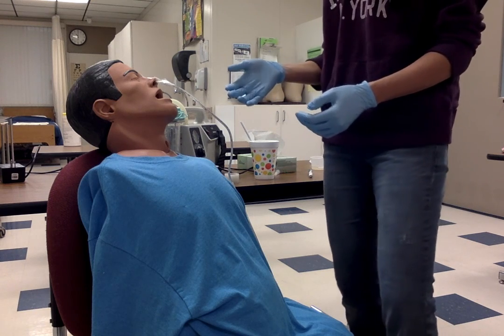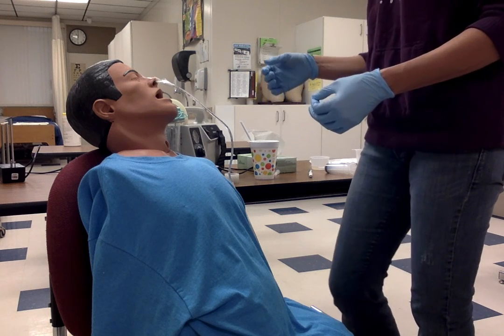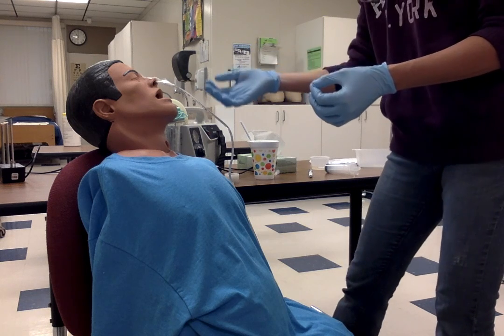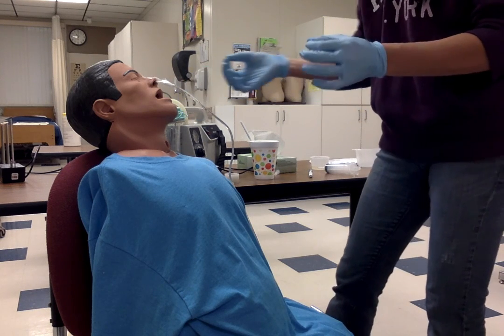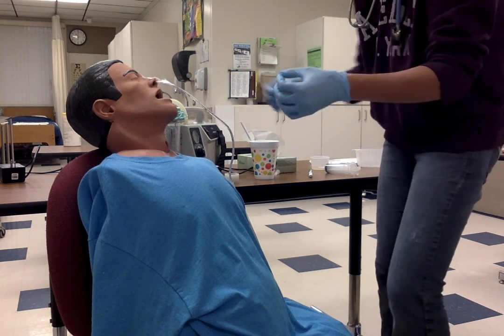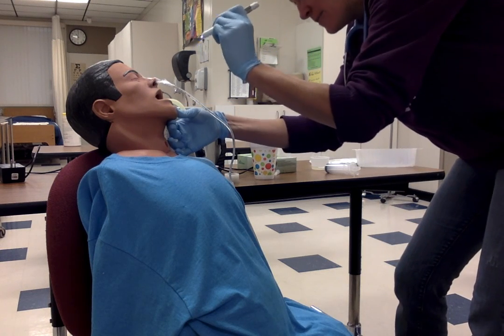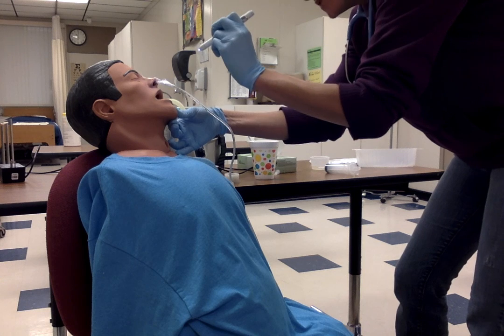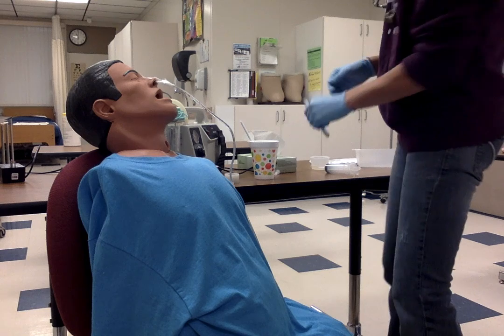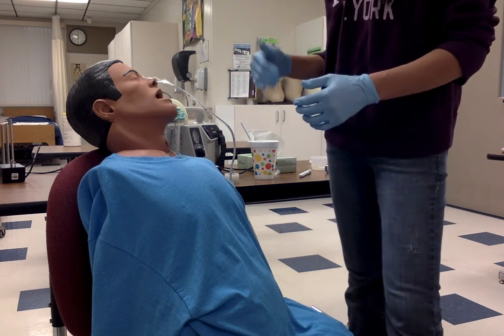Now, I do want to note that as you're inserting this, if you were to have problems and it did not insert nicely, there's a couple different things you can do. So first of all, when you're inserting, if you're meeting resistance, you can look with the pen light. You can open up your patient's mouth a little bit. In with your pen light, you can look in the back of the throat and see if the tube is recoiling. Now, let's say that, yep, it's recoiling, it's not going down. It's not being able to be swallowed. They're drinking and nothing's happening.